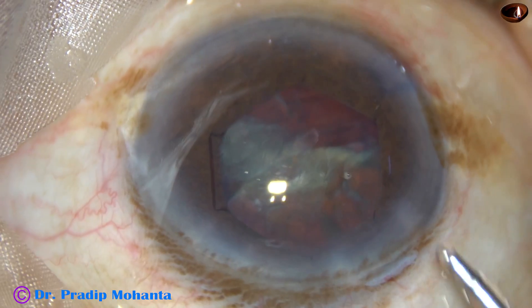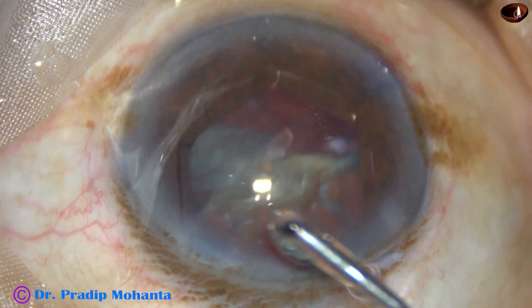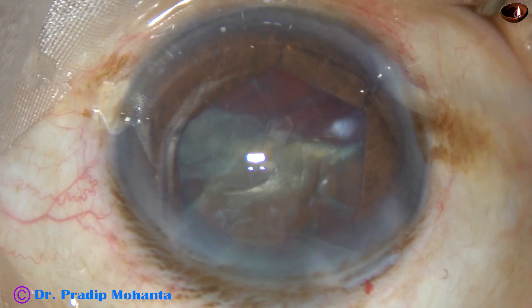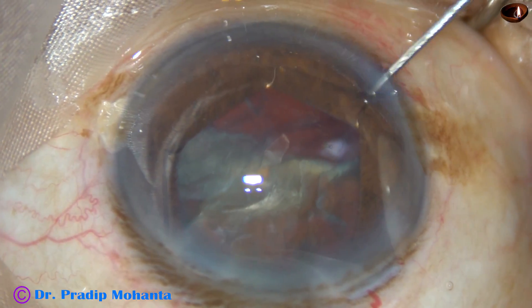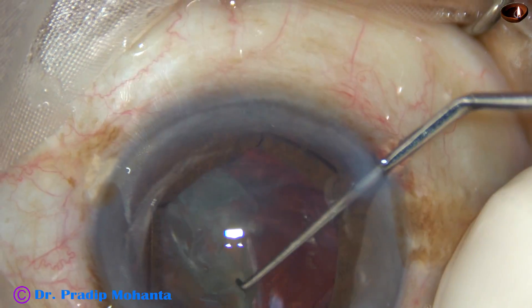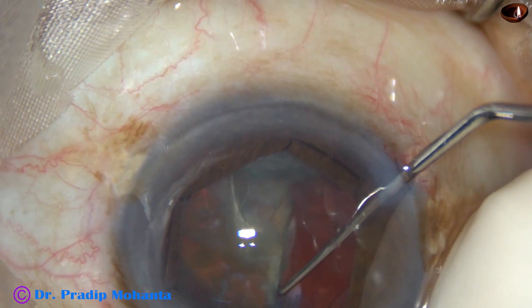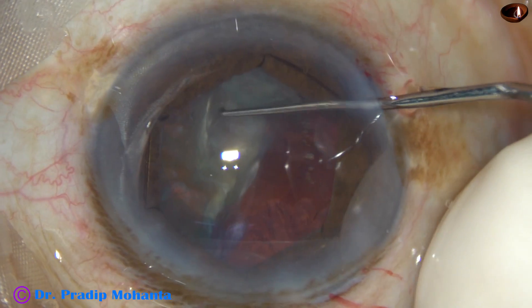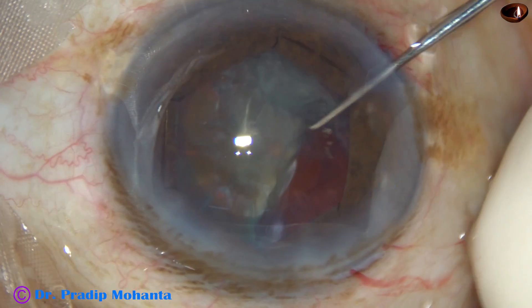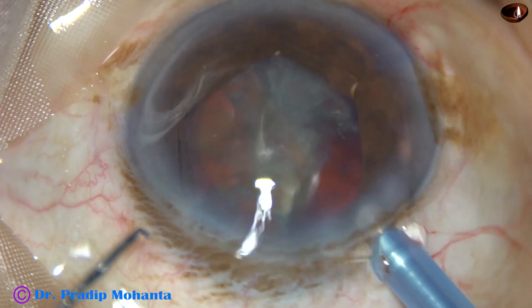B-Hex stands for Bhattacharji Hexagonal. B for Bhattacharji, Hex for hexagonal. This is a hexagonal pupil expansion device invented by Dr. Shuvan Bhattacharji of Kolkata, India. It is a very nice device and all of us Indian ophthalmologists can afford it.